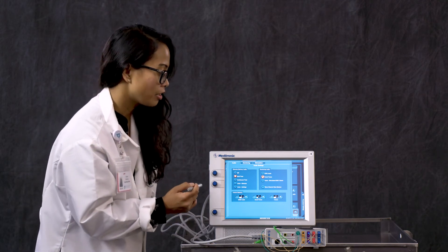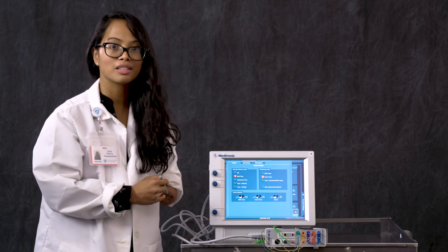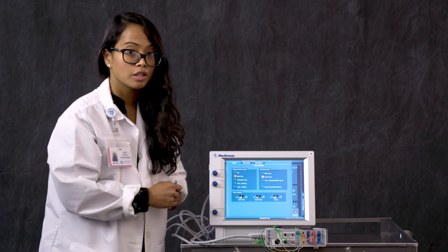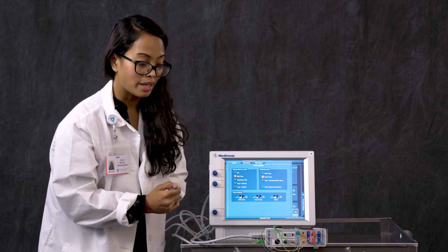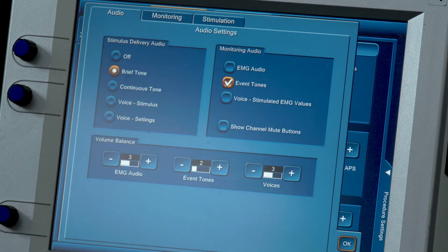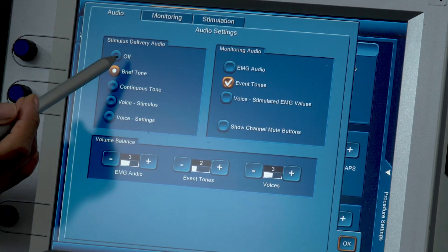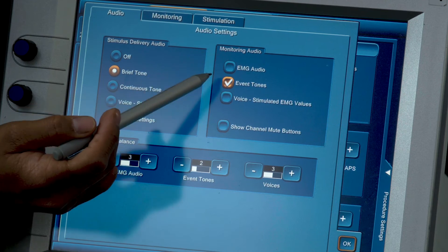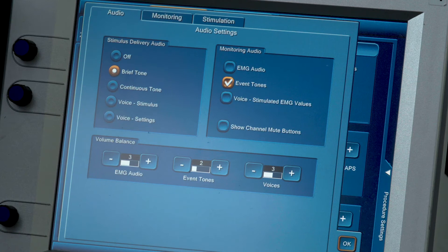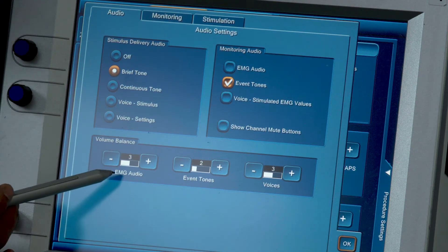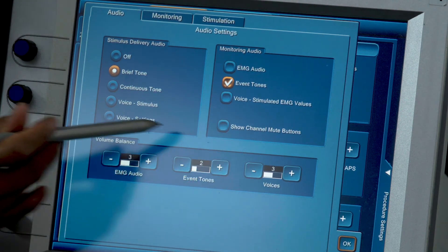So these are the tabs that we are setting up for the monitoring portion. We have three tabs: audio, monitoring, and stimulation. All of these are very important because we want the right information when we are monitoring in real time. Here are the settings that Inspire has suggested and recommended. For our audio tab, stimulation delivery audio is brief tone. The monitoring audio, only the event tones box is checked off. For the volume balance, for the EMG audio we have three, event tones two, and voices three.